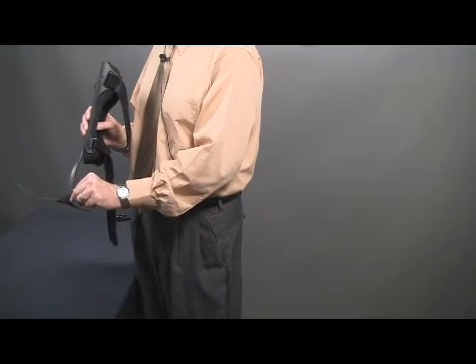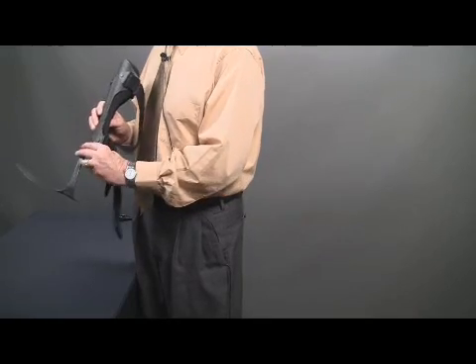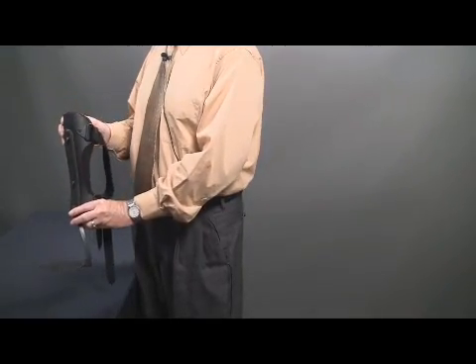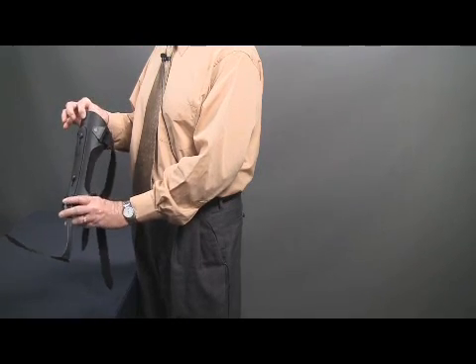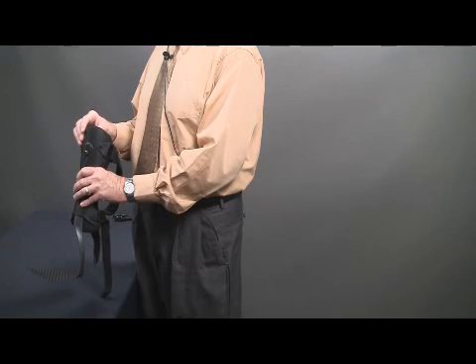This strut always stays about 1/4 inch anterior. You should have no pressure. It should clear it. And you could just grind down that toe plate. You could shorten the shell. You could use the trim lines that are indicated. You could heat it and trim it down and get this one to work just like a small for that patient.